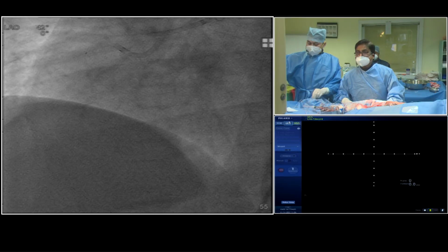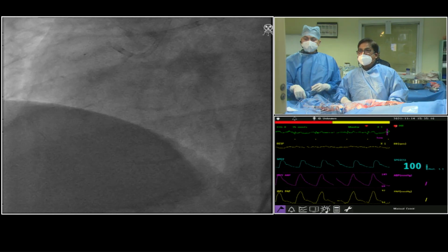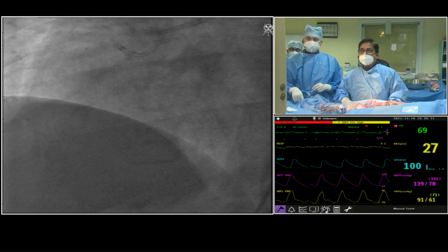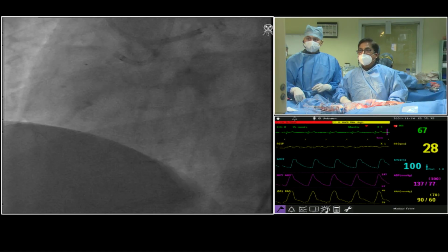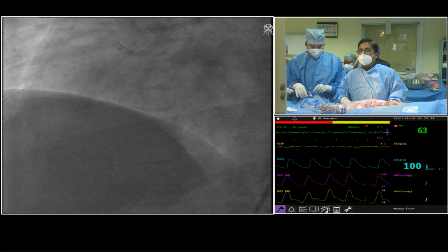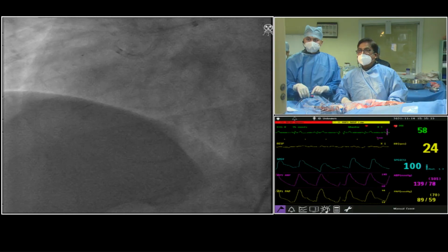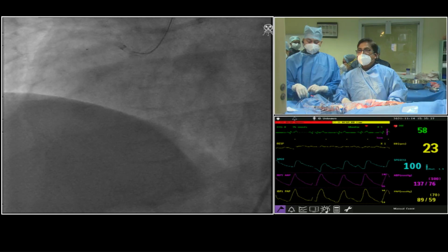Because in several lesions, like I was talking this morning to Pratap, in that case the little guideliner going inside, I could put a balloon, and no microcatheter, nothing could cross after the balloon had crossed a CTO lesion. So support is most important. You get it? So let us see, because this catheter always was coming out. It is at least hanging there.